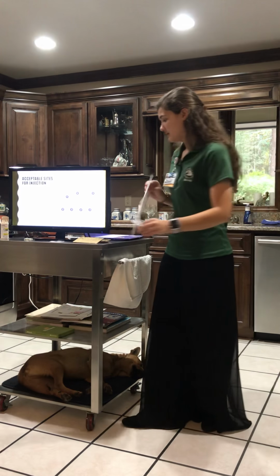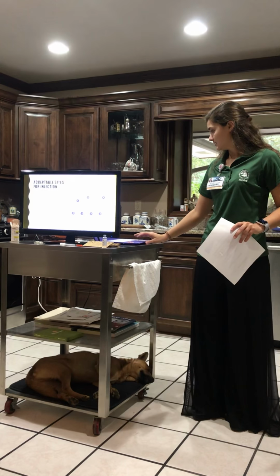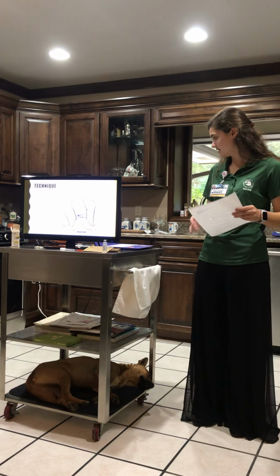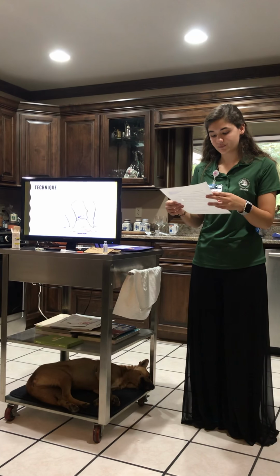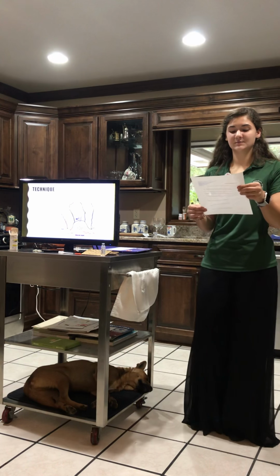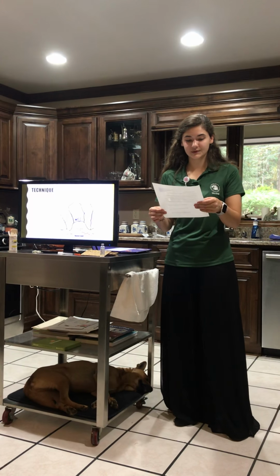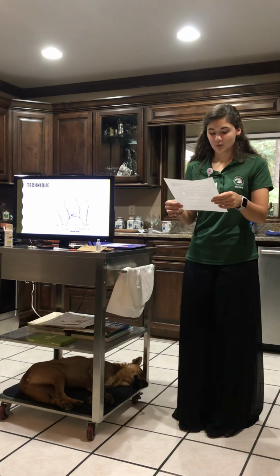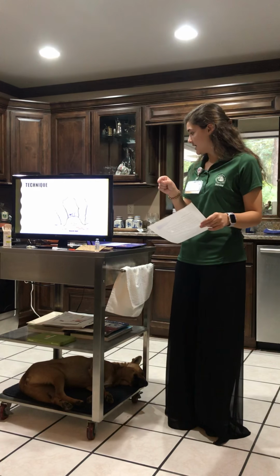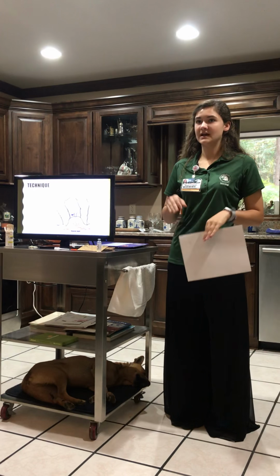I've given you a handout that has the injection technique. So if you'll read with me, injecting correctly, the insulin needs to be absorbed steadily to work properly. And so to put it in there properly, you do want to pinch the skin gently and inject the insulin at a 90-degree angle into your subcutaneous tissue.